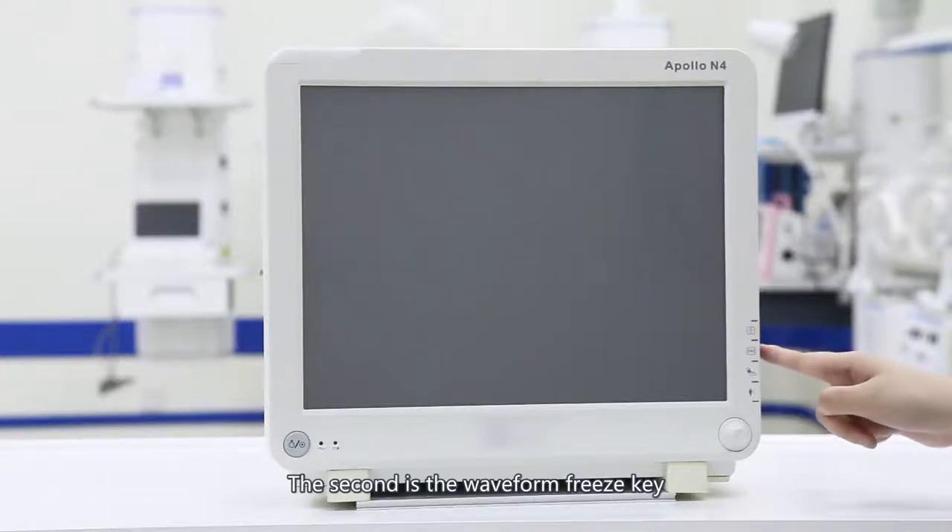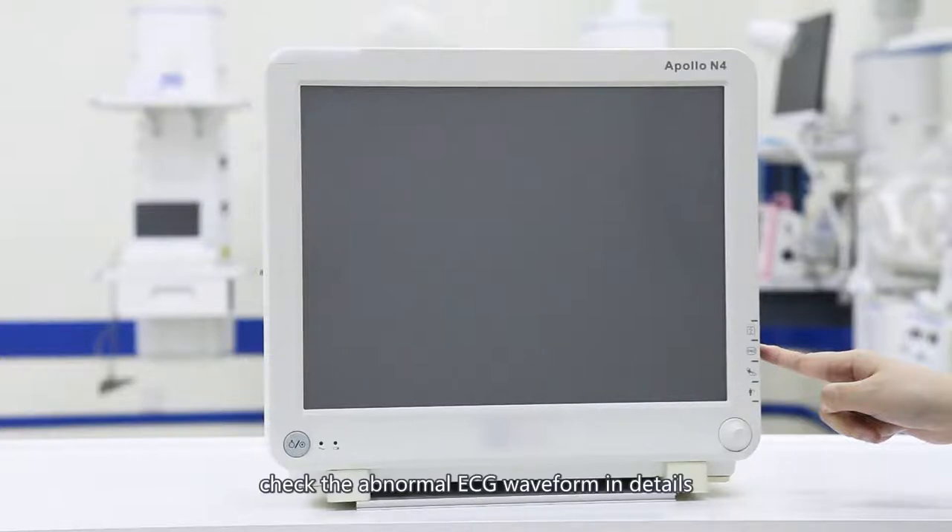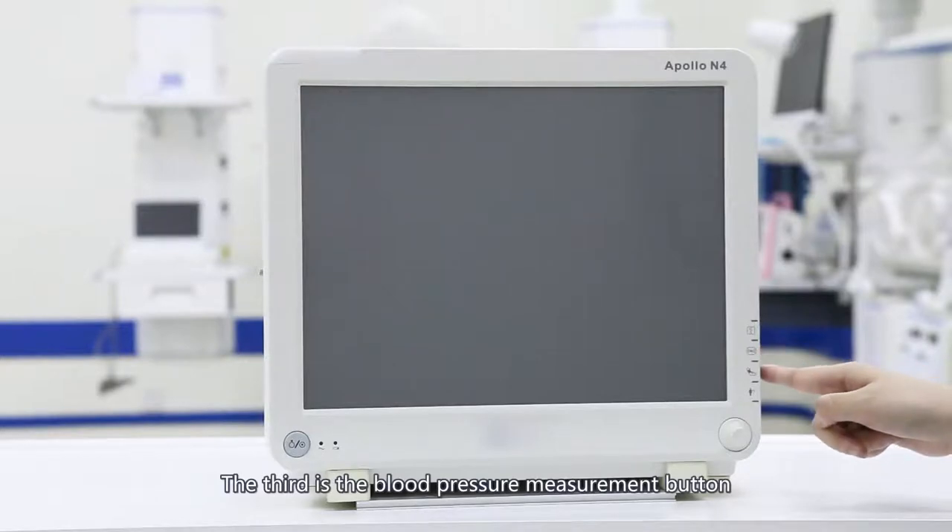The second is the waveform freeze key. A short press will freeze the measured ECG waveform so that the doctor can check abnormal ECG waveform in detail. The third is the blood pressure measurement button. Press it to inflate the cuff, then you can measure blood pressure.